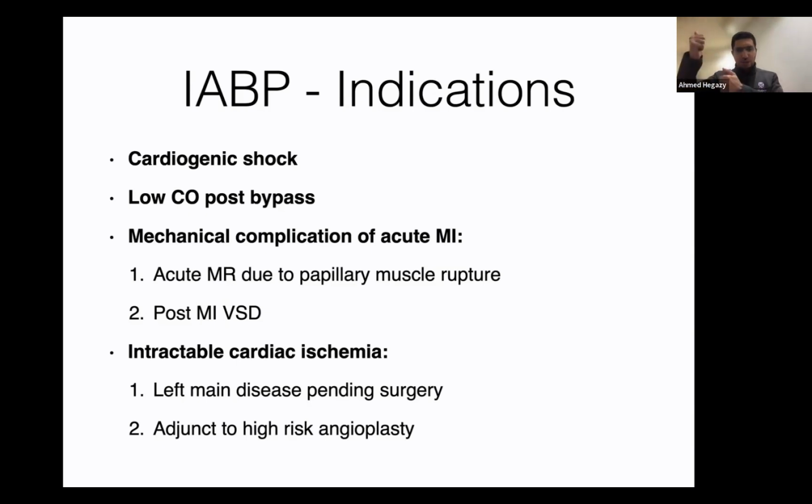Blood can go back into the left atrium because of the severe MR, or blood can go forward through the aorta. Which is lower in pressure? The atrium is lower in pressure. So blood will favor going backwards from the ventricle into the atrium in severe MR. So if you reduce the systemic afterload, you will improve forward flow. You will encourage blood to go forward into the aorta instead of going backward into the atrium.